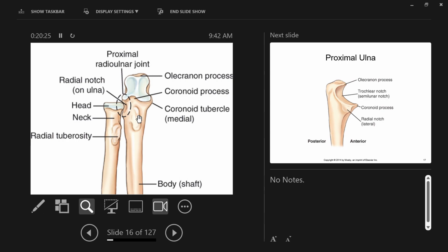When the patient's stuck in some partial flexion position and can't move, you have to change what you're doing. I'll teach you ways to do it. The elbow should be done in full extension like this, right? Those are all laterals up there right now. But anyway, I'll get some other ones up in a little bit. The elbow should be done in full extension, okay? If the patient's stuck in partial flexion, that's not a perfect view of the elbow. So you have to have ways of doing this.